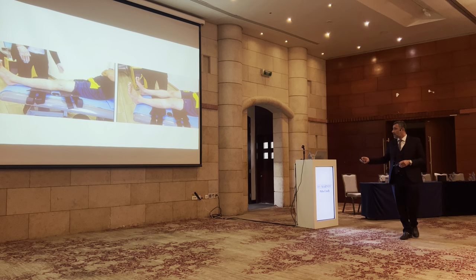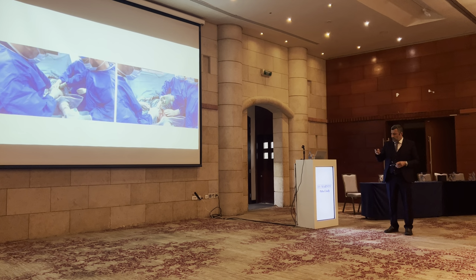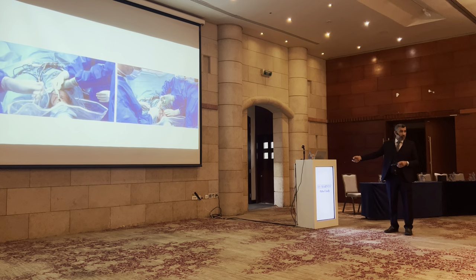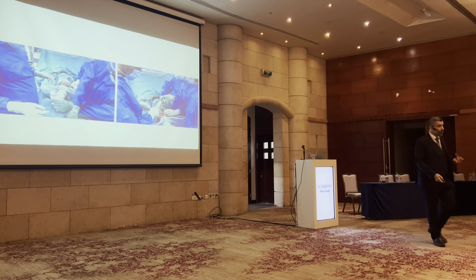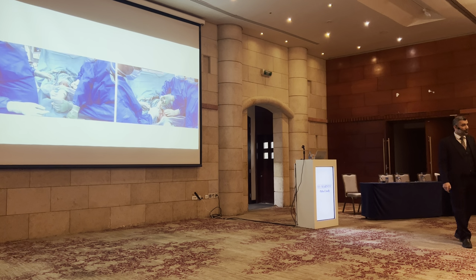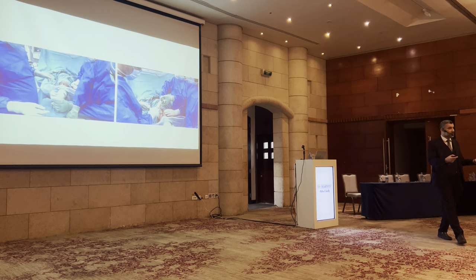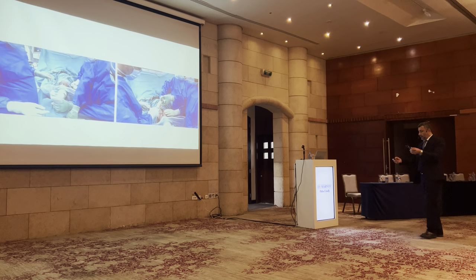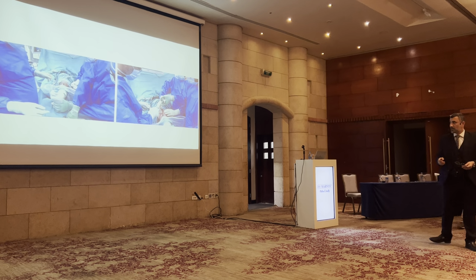And look here, this is what we do during the operation. We tension the graft in full extension. Because if you do a 30 or 10 degree flexion, you should be very, very anatomic. And I do anatomic techniques, but I don't think we are so precise to achieve the normal anatomy of the patient, which all of us know how complex the ACL anatomy is. So we do it in full extension because the patient tolerates some laxity, but never tolerates loss of extension.